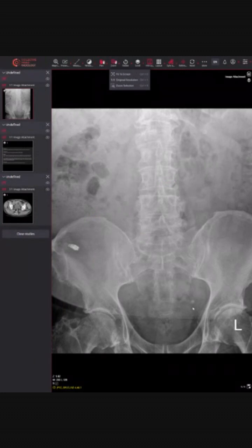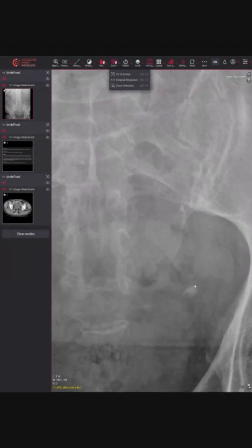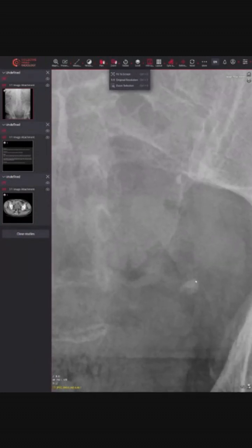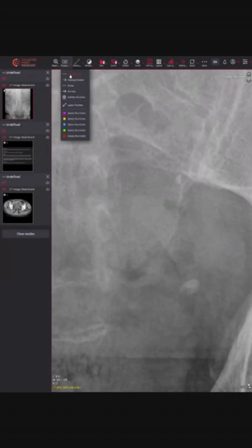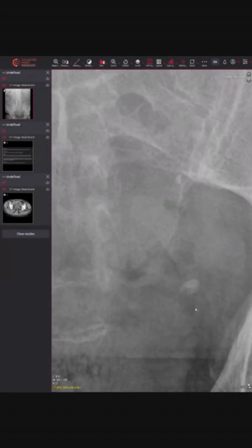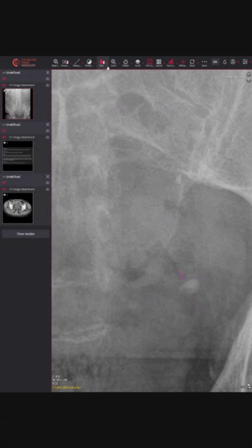We can see we've got the stone there — this calcific density coming in here in the region of the distal ureter.